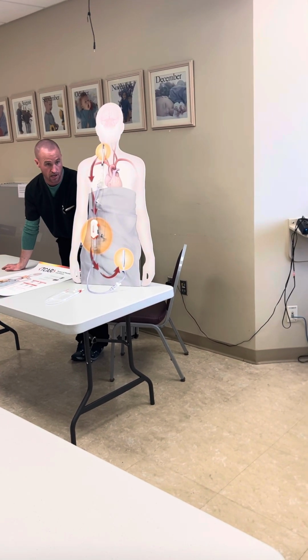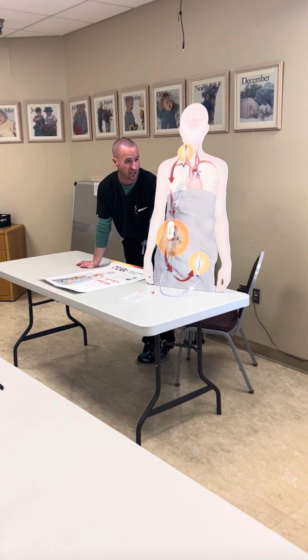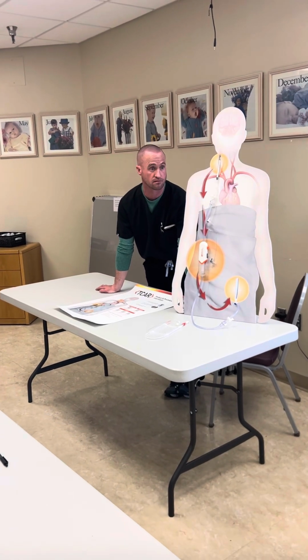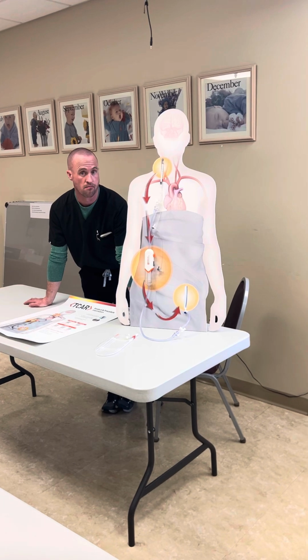Those books are great. There's tons of QR codes, but again, we're here every case. So we're gonna walk you through prepping stents, prepping balloons, and all that stuff's on the table before you start the case, before the patient usually rolls in, truthfully. So if you wanted to open one package, you could.